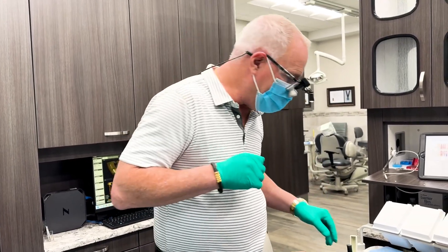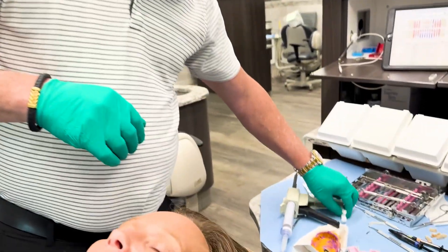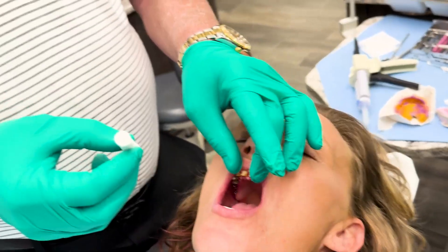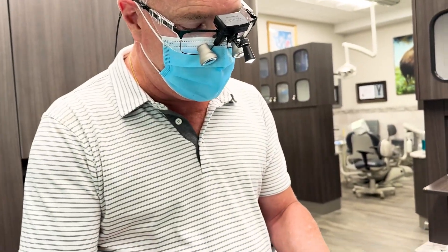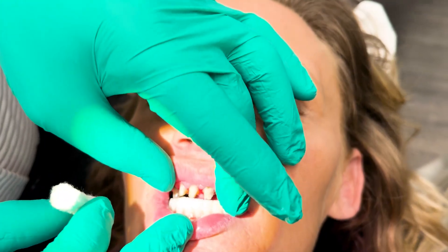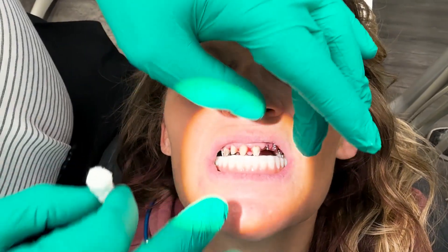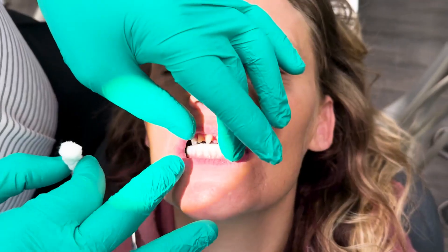I'm Dr. Todd Shatkin, and welcome to this Monday Morning Minute. Today I'm going to show you my cotton roll bite. I've been using this for many years, and it works really well. In this case, we're just going to use one cotton roll, but very often I use two. We've got a temporary lower roundhouse, and we're going to make the upper roundhouse.